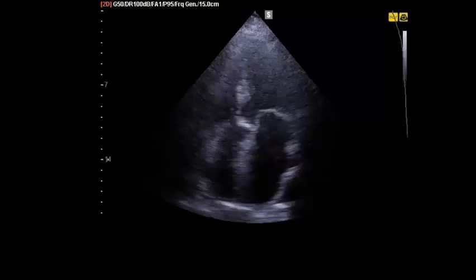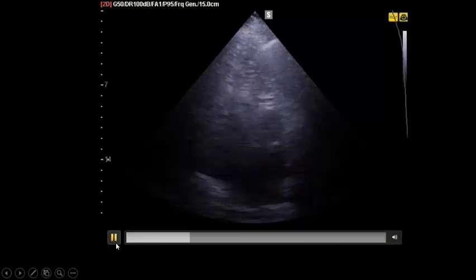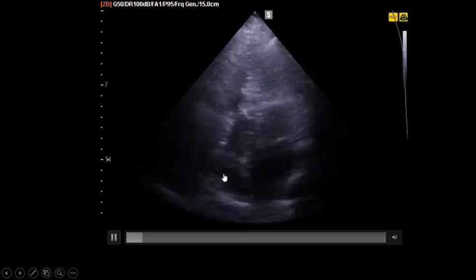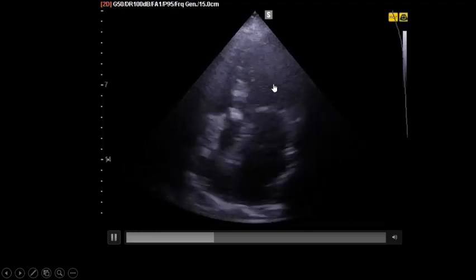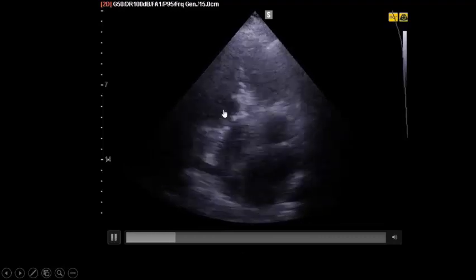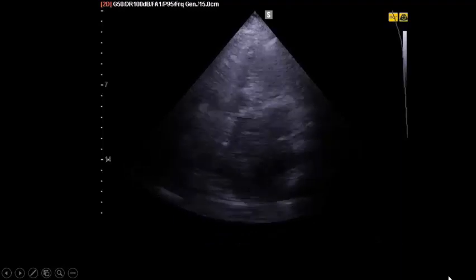Left ventricle: you need to exclude left ventricle weakness, left ventricle failure as a cause of this acute dyspnea. The patient really was morbidly obese. There are not too many views available. We did this 5-chamber view. From the first impression, you will see the left ventricle is small and contracting, but the left atrium is markedly dilated. The right side is not ballooning and there is no significant pericardial effusion. But now let us go step by step.